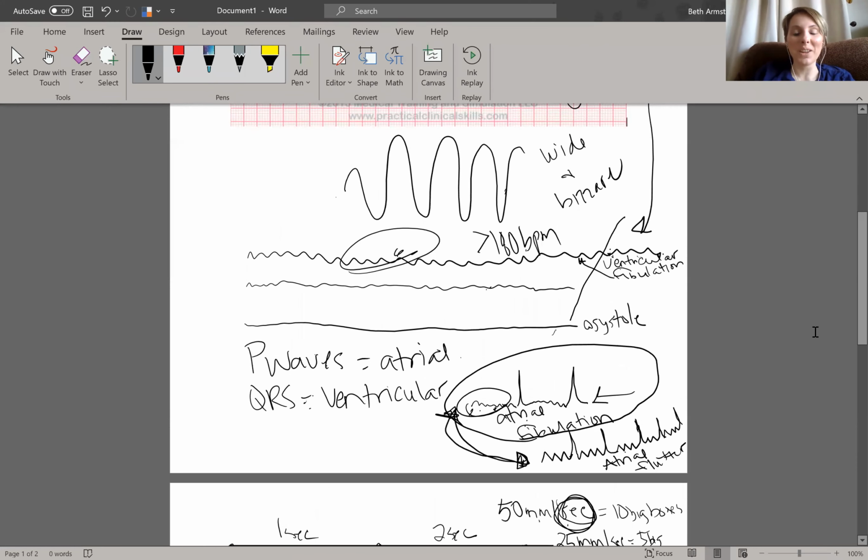Because we think, oh, atrial fibrillation, oh, flutter. Yeah, that would be flutter, right? Because it's fluttering through. No, this is fibrillation because it looks just like ventricular fibrillation. But flutter is the sawtooth. It's the horror story of cardio.